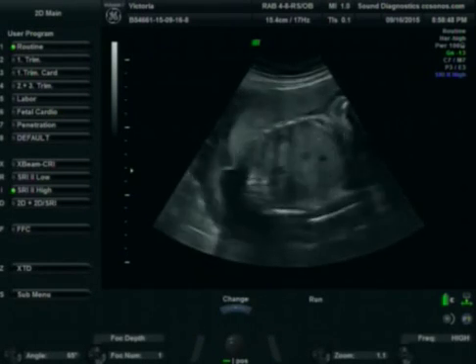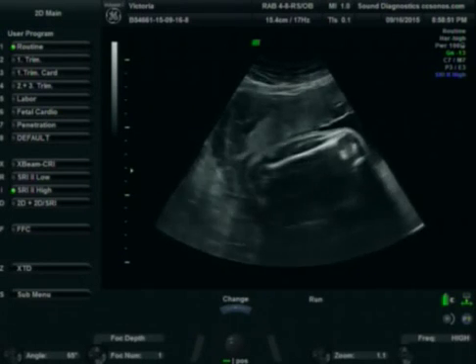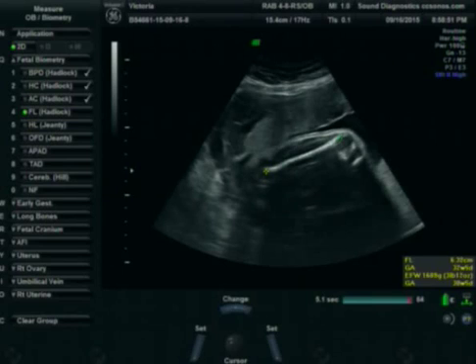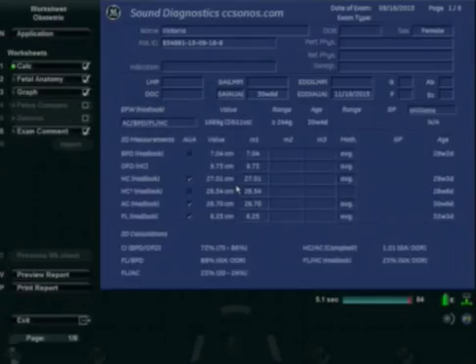And the leg bone. Estimates 3 pounds, 11 ounces. Estimates 30 weeks, 6 days, and a due date of 11/19. So what is that, like 12 days off? Showing a little bit ahead of schedule there, huh? She's aiming for my due date.